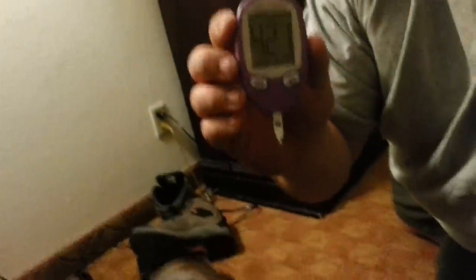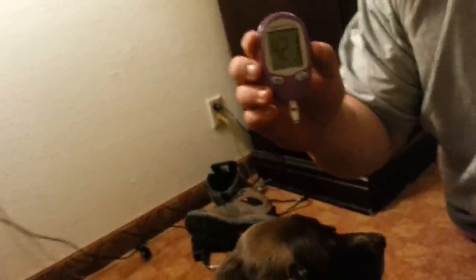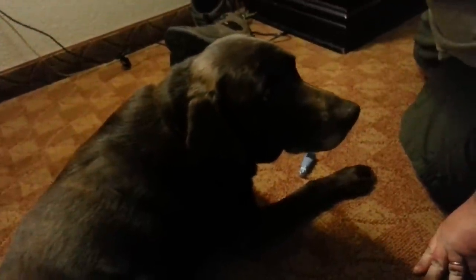Now Rogue just ate a little while ago and she's actually at 421. That would scare you if you thought that's what she was maintaining, but what's happening is her insulin is probably just starting to work. So if we tested her again she'd possibly be down to like 300, and then in a couple more hours she might be down to 200 and back to what she was prior.